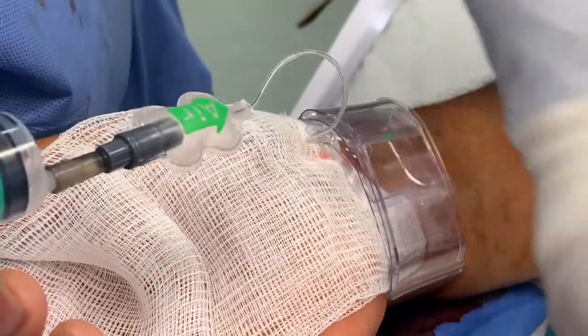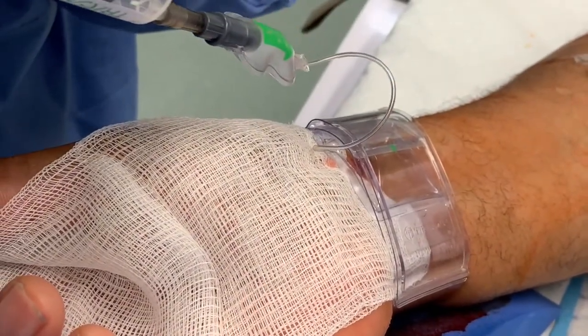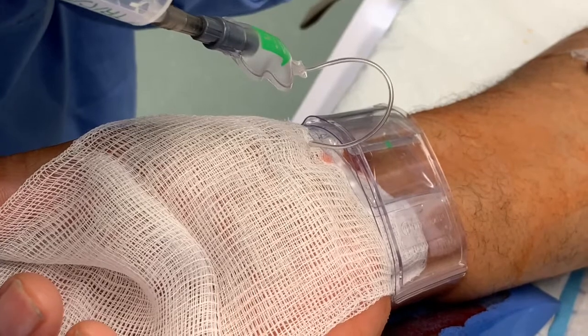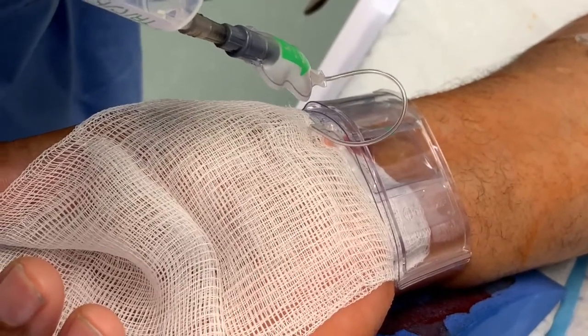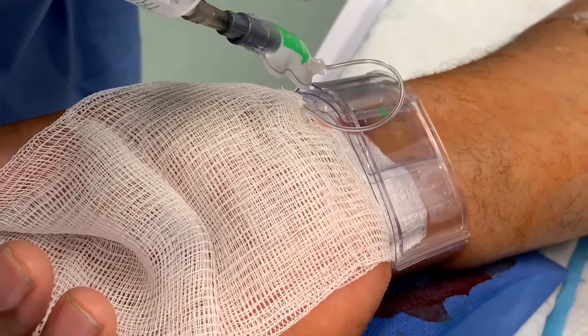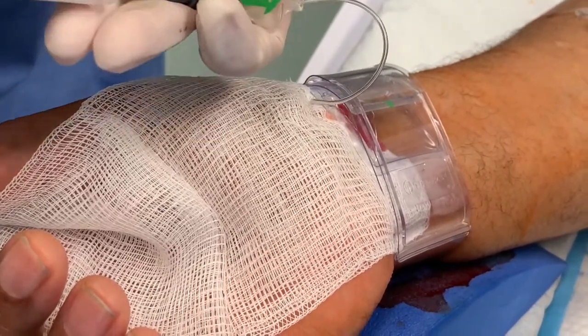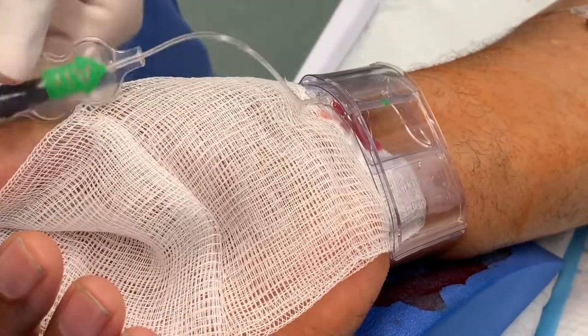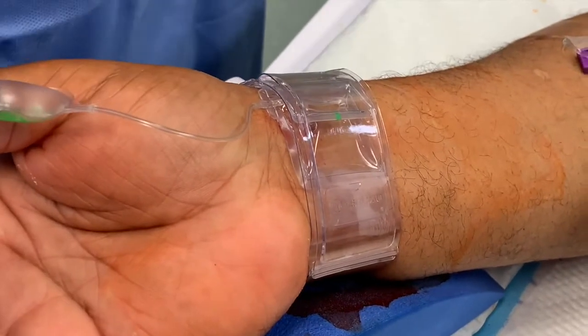Notice we have left the gauze behind, which we will remove in a second. The air is let back into the syringe to allow for a little bleeding, and then we reinflate to ensure hemostasis. The syringe is removed and the gauze is removed, taking away the blood.